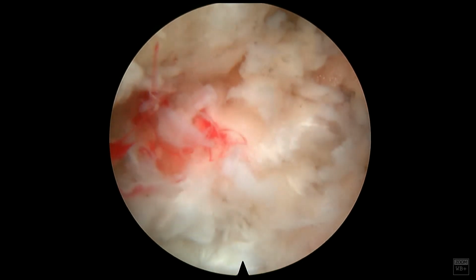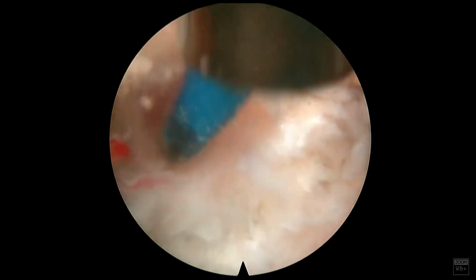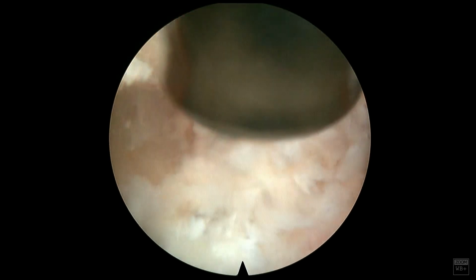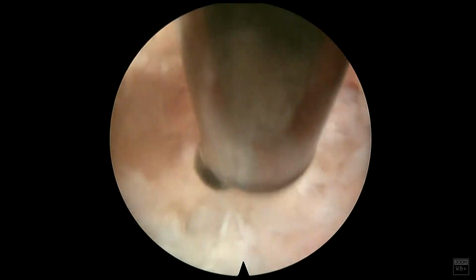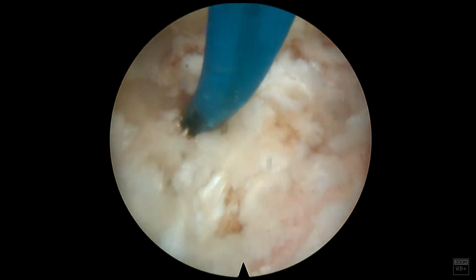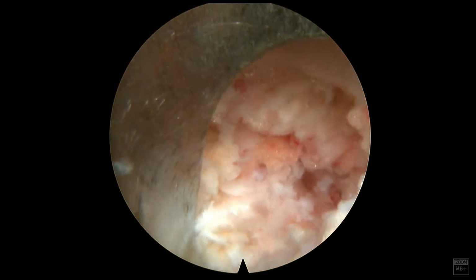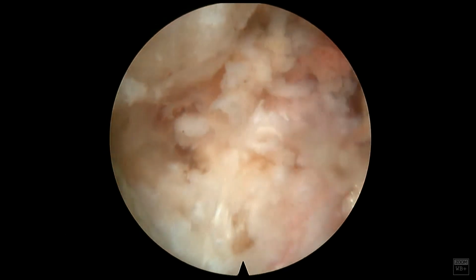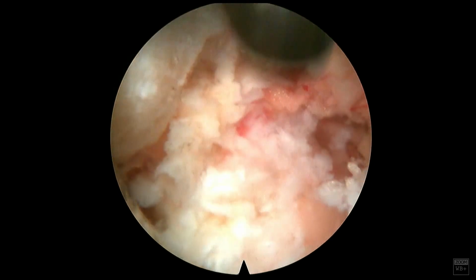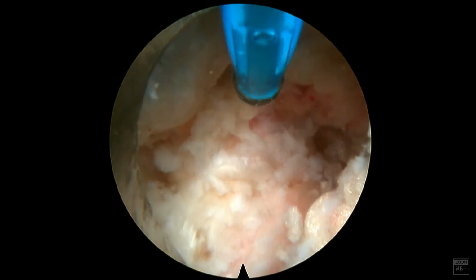And so, again, I control some of his bleeding with the RF probe. You want to make sure that you control some of the bleeding just to make sure you don't have any epidural hematomas. I have had a couple of cases where the water pressure will kind of stave off some of the epidural bleeding, and then you take the tube out, and later on they have continued radicular symptoms, or they have an epidural hematoma because there wasn't as much bleeding as you thought there was. So this is where we check our decompression.